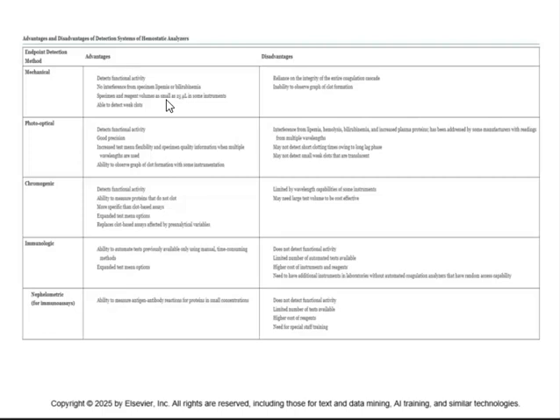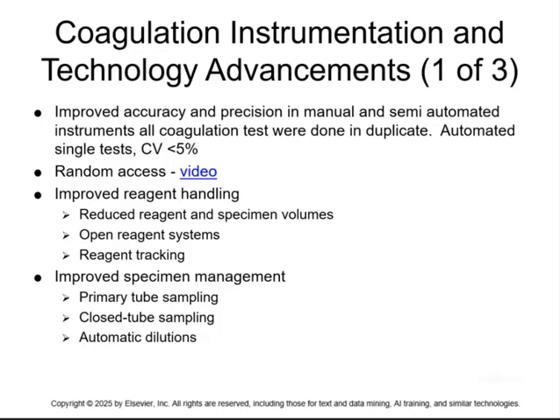It might not detect a very short clotting time. You know, the mechanical really doesn't show the graph of the clot formation. So there's advantages and disadvantages in each. So you've got to see what method you're going to end up using in your lab.